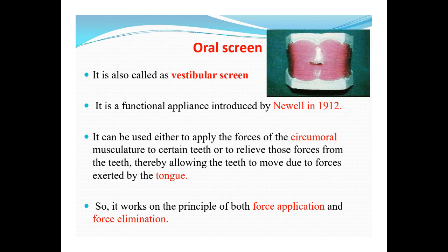It acts on the principle of force application and force elimination. In children who have this mouth breathing habit, the mouth is kept open for a long period of time. So the lip becomes very hypotonic or very relaxed. It is not in proper muscle tone, whereas the cheek muscles are hypertonic. They are very stretched and exert excessive force.